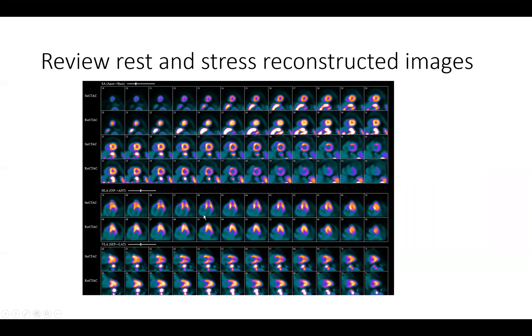These are the traditional rest and stress images — rest on the bottom, stress on top. We go immediately to analyze the short axis of the rest images. We can see a complete donut, however this donut cavity appears to be very small with almost obliteration of that cavity at least from the mid ventricle up, as you can see in the vertical long axis. We don't have any perfusion defect per se, but we have this very small LV cavity and bright uptake everywhere else except at the base of the heart, which is probably signal averaging in these semi-quantitative images.